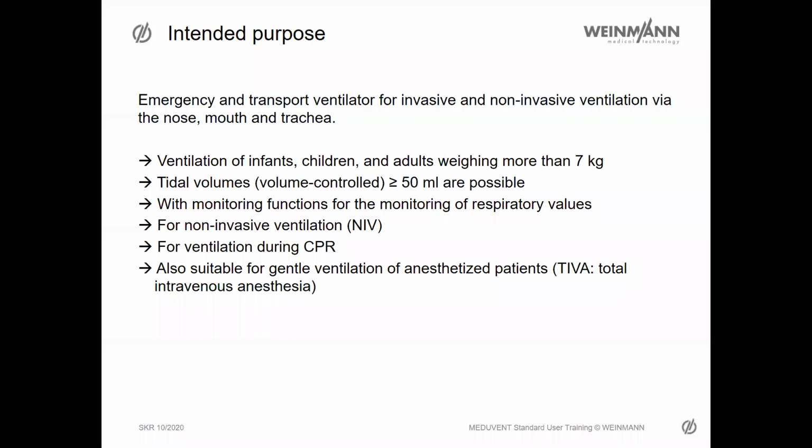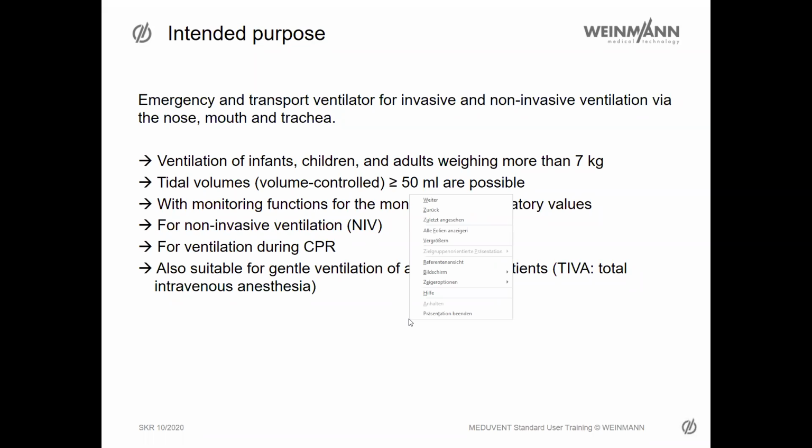So also the MEDUVENT standard is flexible for doing the non-invasive ventilation and to ventilate during the CPR. Also suitable to anesthetized patients. So when the patient will get a TIVA, you can use the ventilator as well.